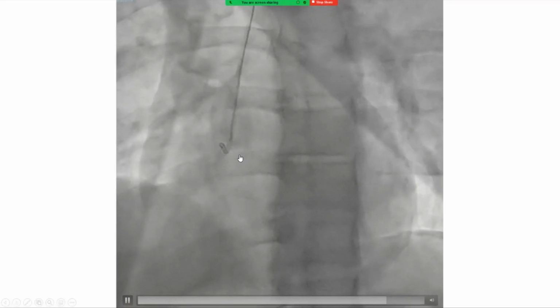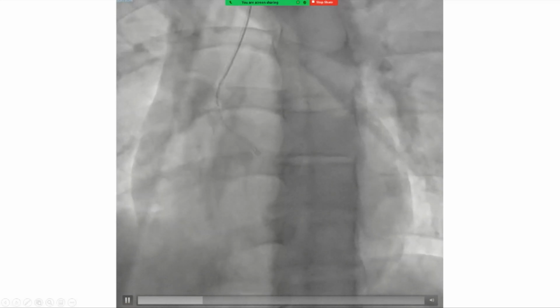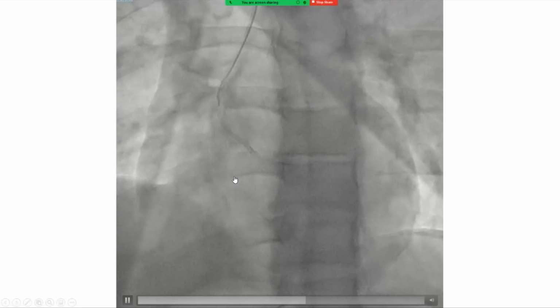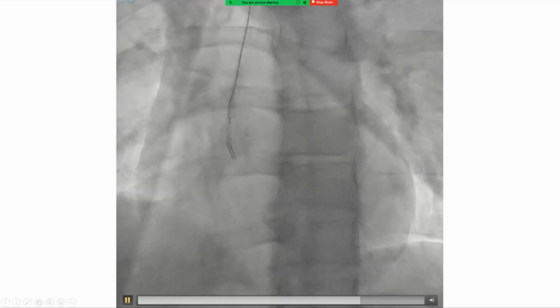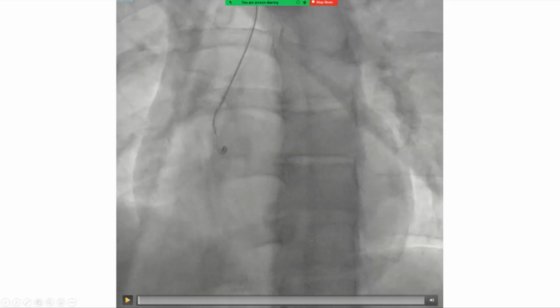And then as you're clocking, midway, he pushed on it to give it the duck shape. So here again, elongated and free, clocking, then pushing to make it duck shape toward the midway of clocking. And that achieved successful engagement.